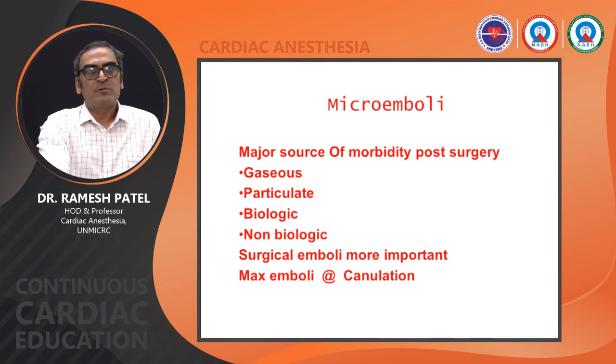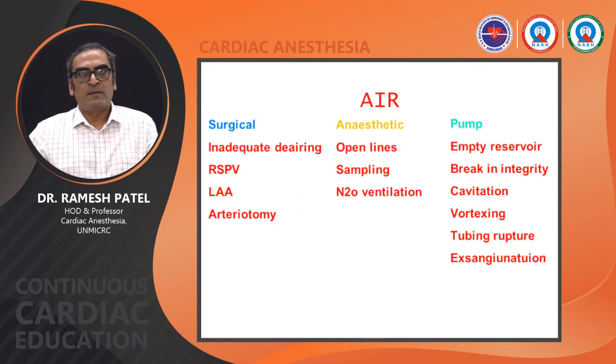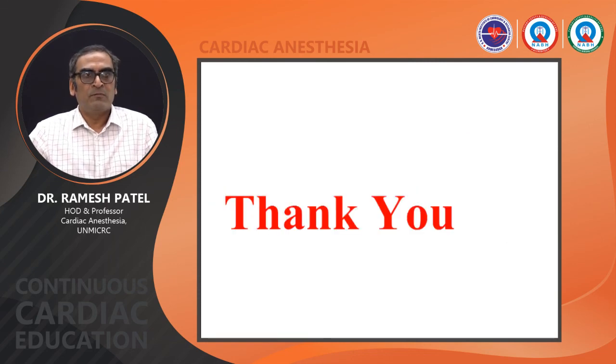Of course, we need to check for microembolization of air as well as wax or some debris, fat. So always check for embolization. Always close all the ports of the central line as well as peripheral line. After checking all the ports and taking care of embolization and neutralization of heparin, the patient is off pump, and of course we have checked for post-CPB coagulation, and the patient is ready for shifting to the ICU.